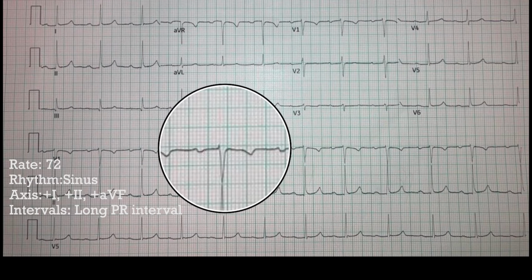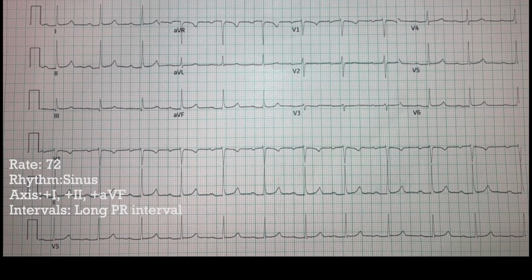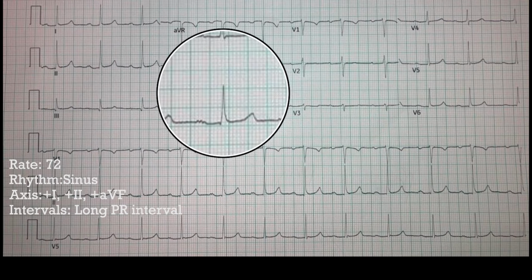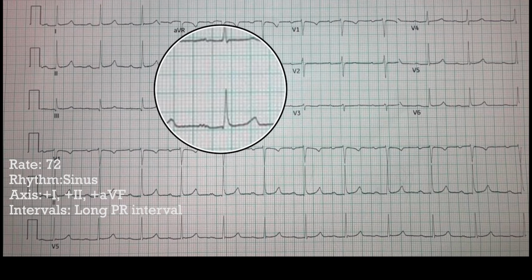And it looks like it's done by two little boxes. So this is a narrow complex QRS. And then looking at the QT interval, we find that, going peak to peak on the QRS complexes or whatever you want to say, we're just estimating.